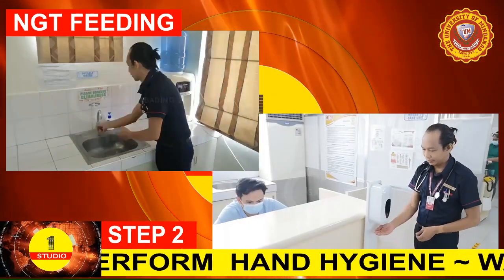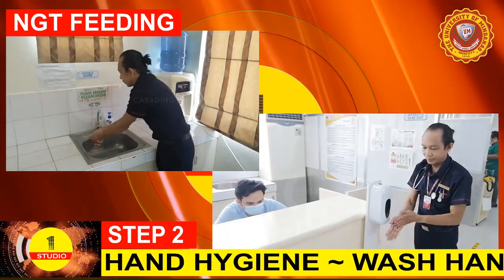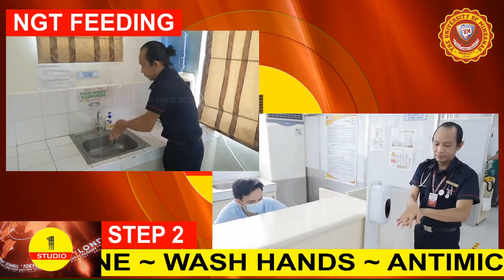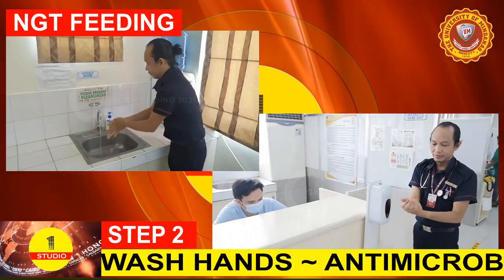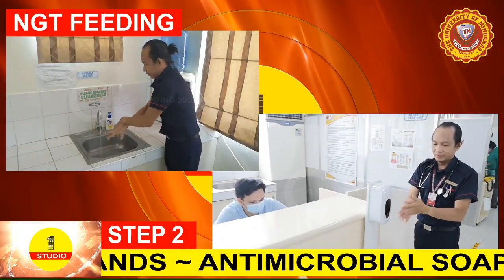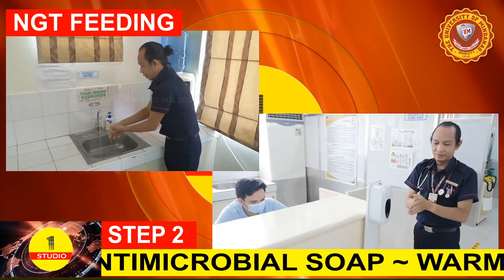Step 2. Perform hand hygiene, either by washing your hands with antimicrobial soap and warm water, or perform a hand rub using a 70% alcohol-based hand rub.